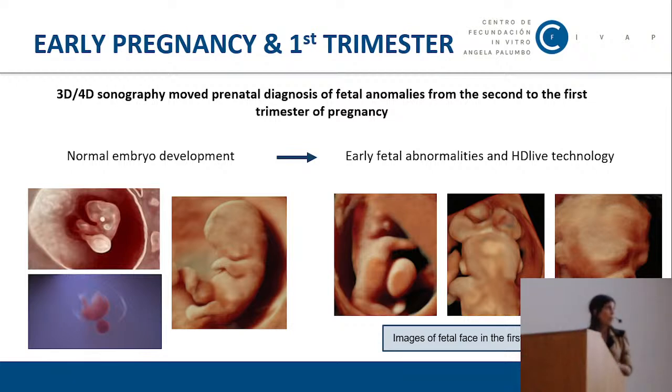I'm asking you a question. Images of fetal face in the first trimester, yes or no? Since we have the machine, we always try to get 3D pictures at any stage, but it seems to be counterproductive to show a 3D image of the fetal face to the parents during the first trimester if it's not for medical reasons.